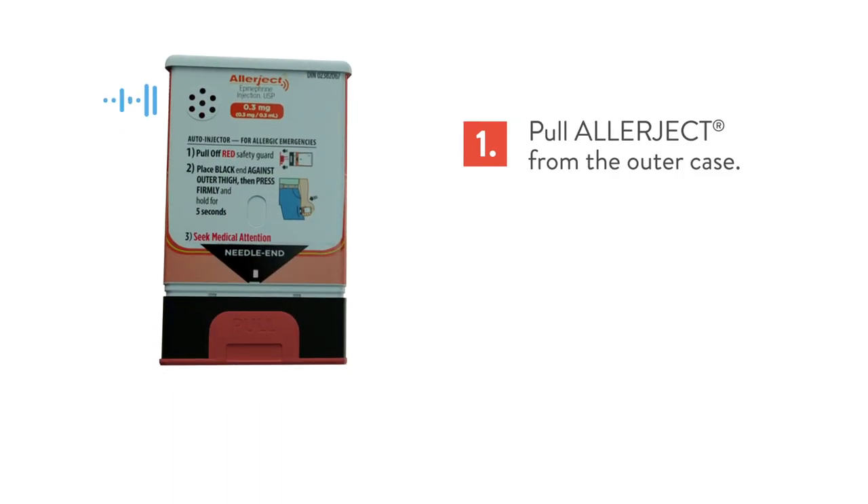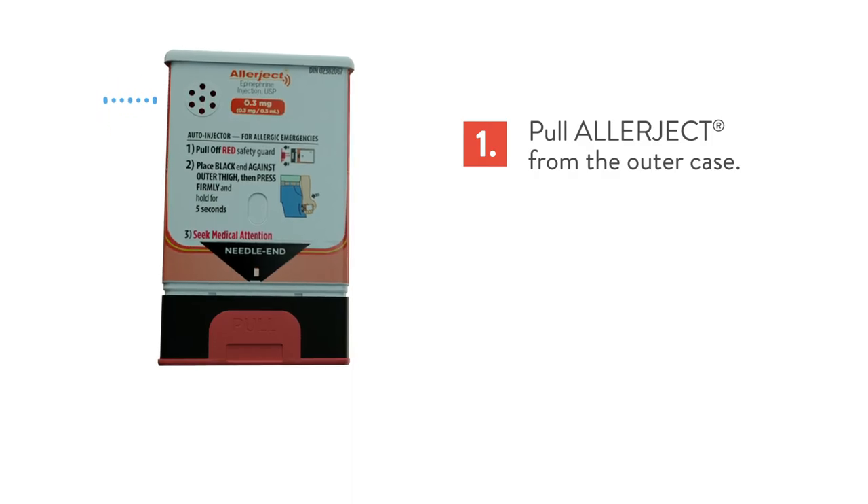If you are ready to use, pull off red safety guard. If not ready to use, replace the outer case.